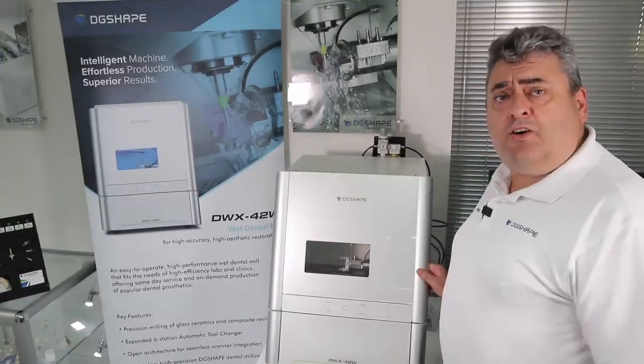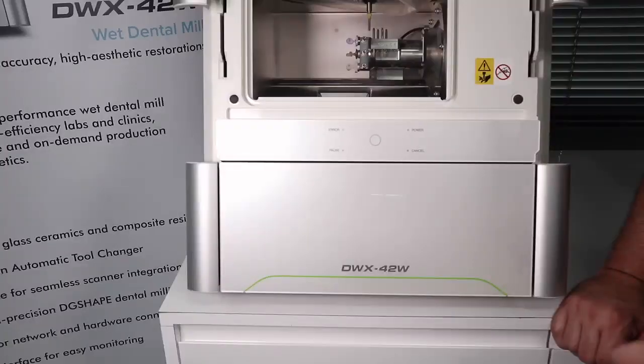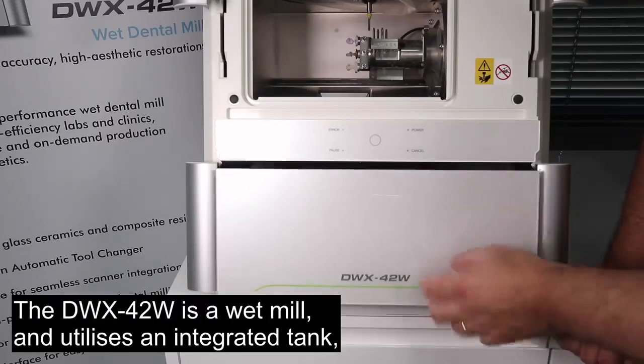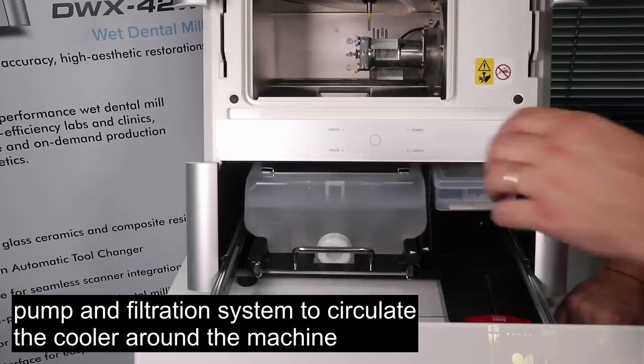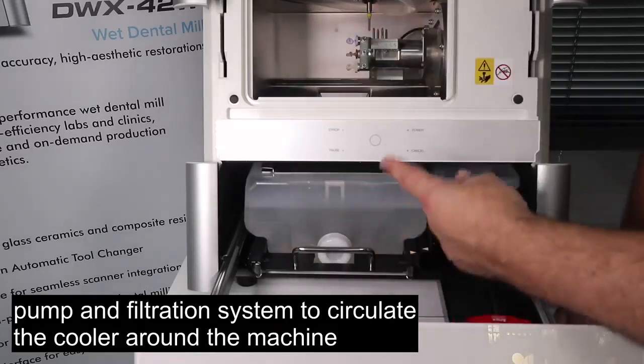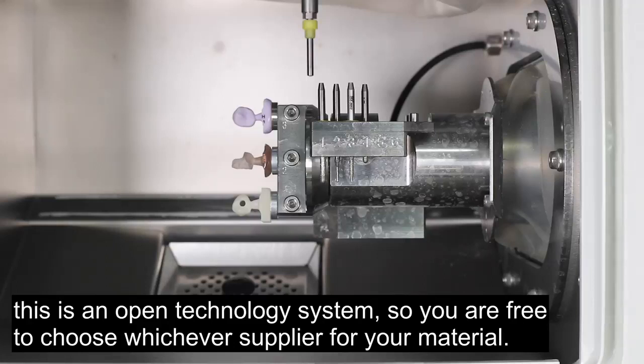Let's take a look at the DWX42W. The DWX42W is a wet mill and it utilizes an integrated tank, pump, and filtration system to circulate the coolant around the machine. Just like all our other mills, this is an open technology system, so you are free to choose whichever supplier for your materials.